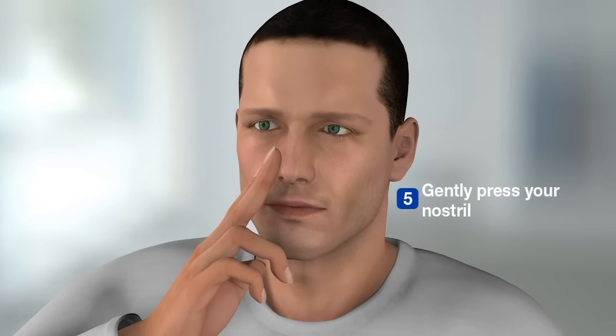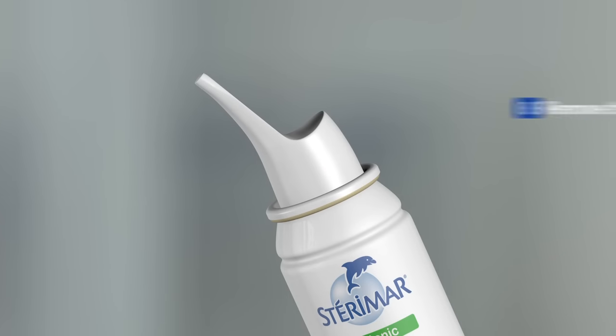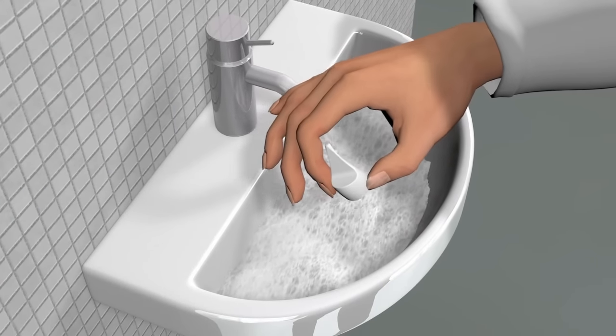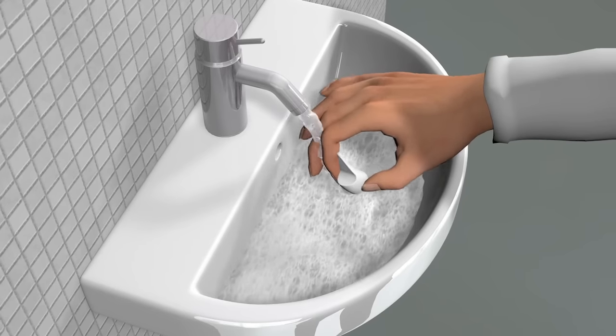Once you have used the spray, remove the can and then gently press your nostril. Blow your nose and then repeat this process in the other nostril. Once you have followed these steps, remove the nozzle and clean with soapy water to remove any remaining germs on the nozzle.